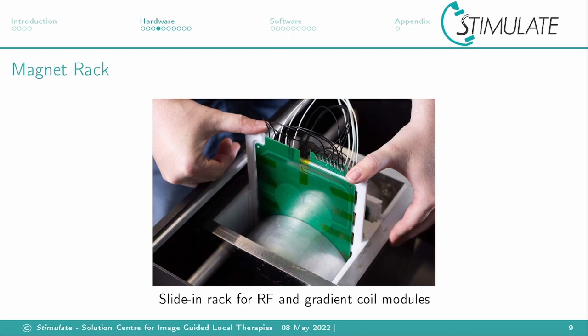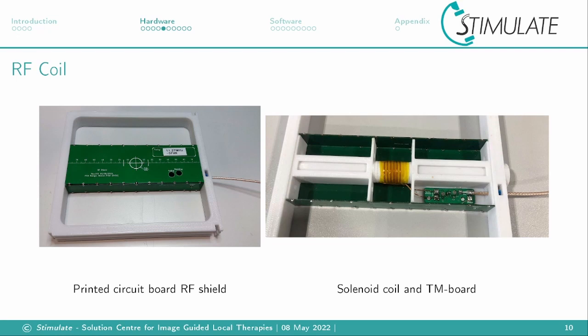The magnet contains a 3D printed rack where you can slide in the electronics. Here you can see the planar gradient coils. The RF coil is basically the same design as from the Martinos Center. Just a piece of copper wire as a solenoid coil around the chemical test tube.